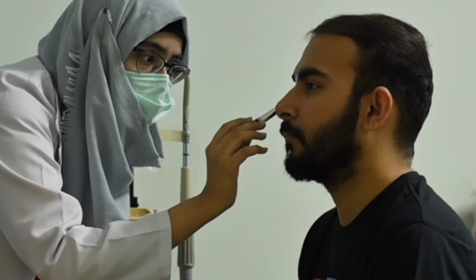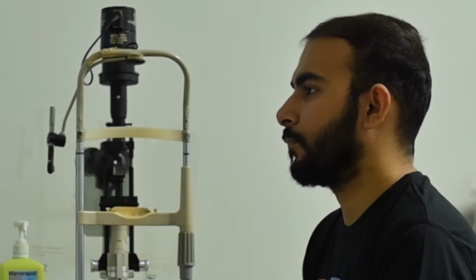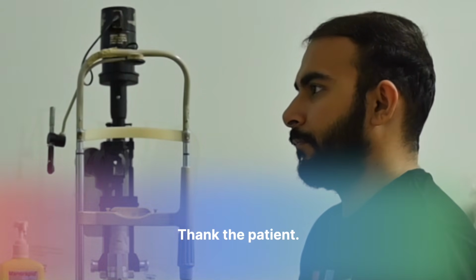Yes, the pupil is constricting. Okay, that means that there is no RAPD, no relative afferent pupillary defect. Thank you so much.